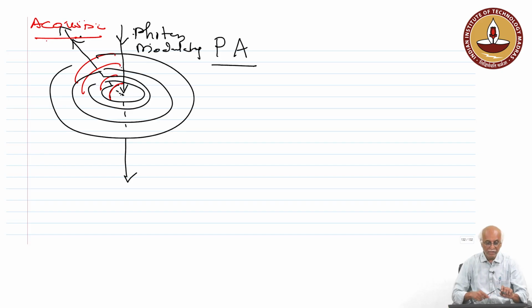So, today we will continue with photoacoustic techniques for maybe tomography applications. Okay, photoacoustic tomography. So, as yesterday, we were talking about the photoacoustic signal which is generated by an optical pulse, most of the time lasers. So, the laser pulse interacts with the tissue, and the tissue absorbs part of this light, right.